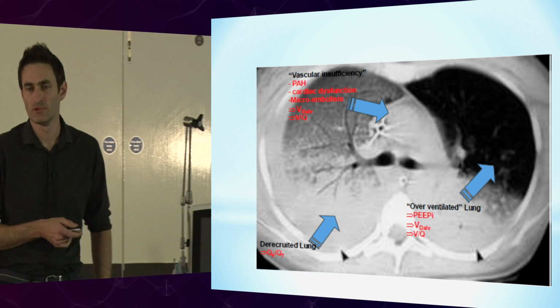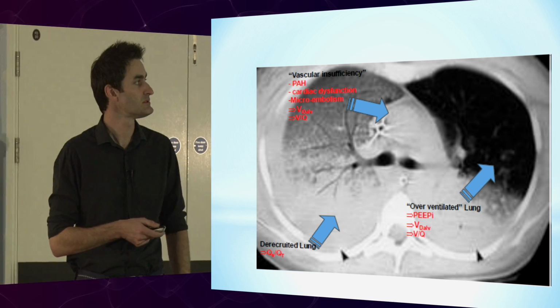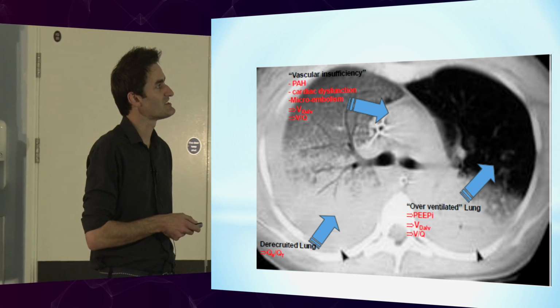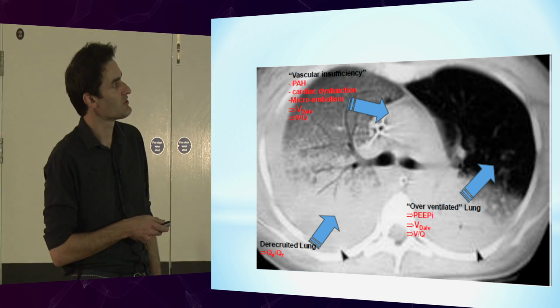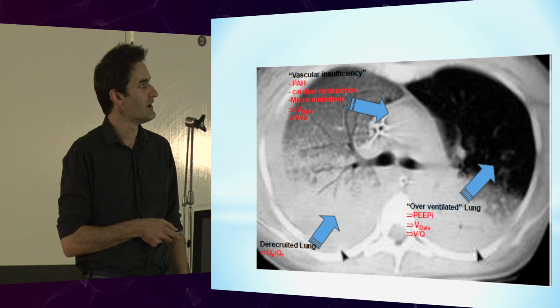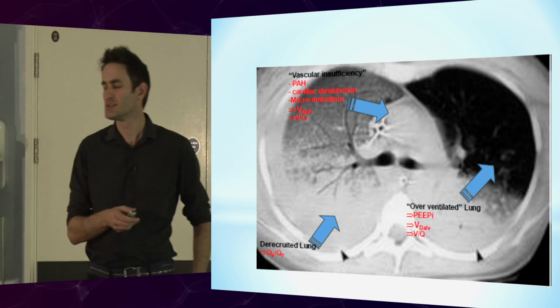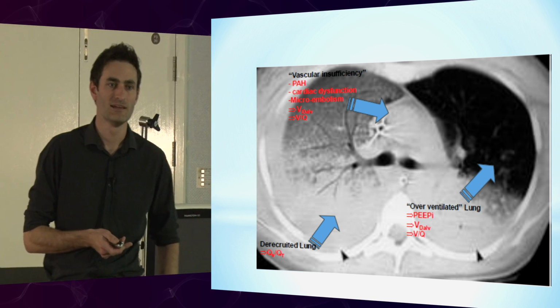Where's the normal lung? Anybody? Is there any normal lung there? Just a bit of a clue. So this isn't normal either here. There's certainly some fluid there, some consolidation. The normal lung, which actually isn't really normal now, is this bit, or at least it was normal. Why am I saying it was normal? So have you all heard about this concept of the baby lung in ARDS?